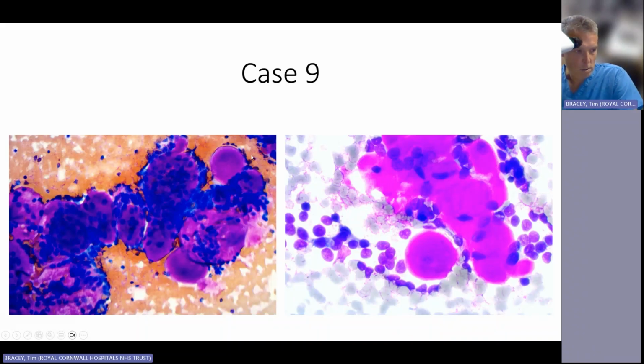And there were these balls of stromal material, really well defined, sort of cookie cutter appearance, and then the cells are quite hyperchromatic. These are epithelial cells, not lymphoid cells. You don't have very nice myoepithelial cells or plasmacytoid cells floating around. You've just got these angulated cells that are generally separate from the stromal material.